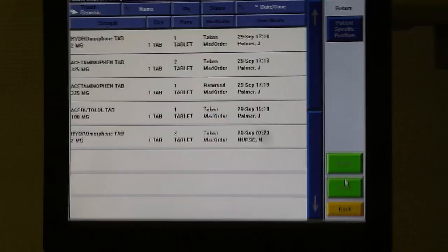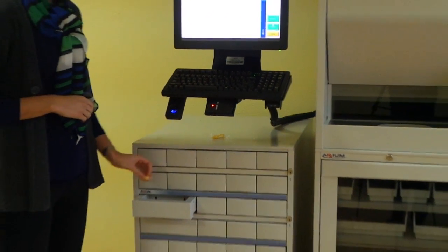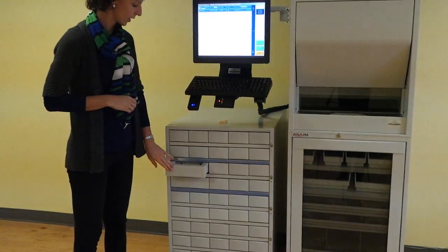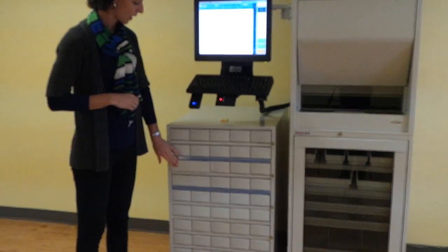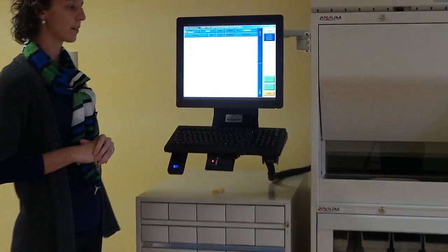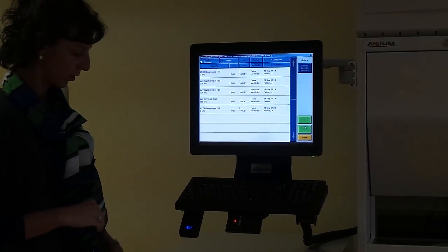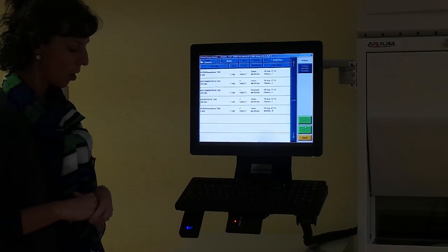The return drawer will then open. Simply drop your medication in the drawer and close it. You are now complete with your return.